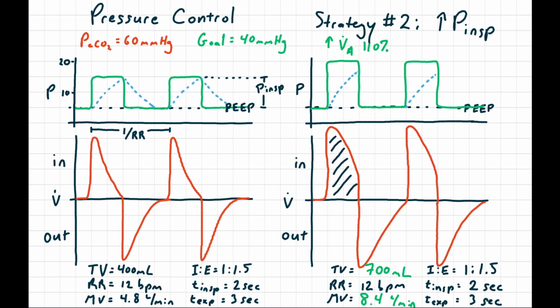The lesson here is that in real life, the tidal volume change for a given inspiratory pressure change is a little bit unpredictable. Often it'll be a fair bit higher or lower than you think it will be. Generally, you have a goal tidal volume in mind and adjust the inspiratory pressure little by little to try to hit that tidal volume. Or you use an advanced mode like pressure-regulated volume control that does that iteration for you.